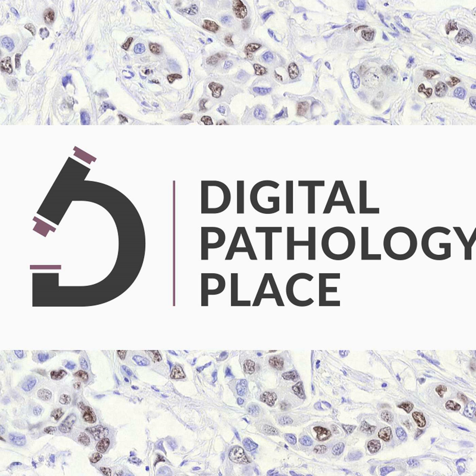We are going to start with paper number 1, which is Artificial Intelligence-Based Digital Image Analysis for Assessment of Ki-67, P53, PHH3 Expression in Glioblastoma Multiforme. And I did prepare for you what these markers are for. So the Ki-67 is proliferation index, P53 tumor suppressor status, and PHH3 mitotic marker. Ki-67 is for proliferation during the whole cell cycle, and PHH3 is specific for whichever phase of mitosis. I think it was G2.